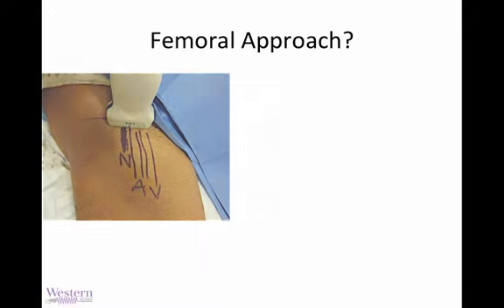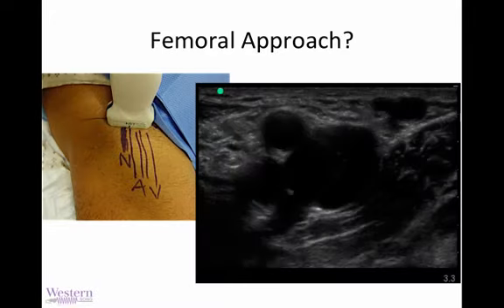Now, the femoral approach is easily done. The inguinal crease is the place to put the probe. Again, the index mark rules with the probe and the machine apply, line them up so they are aligned, pointing in the same direction. And the vessels and the anatomy are as you remember them from the blind approach.